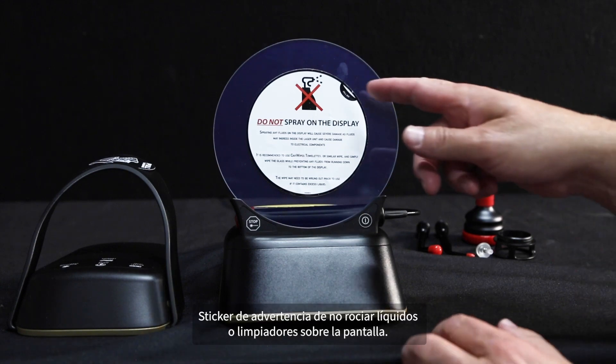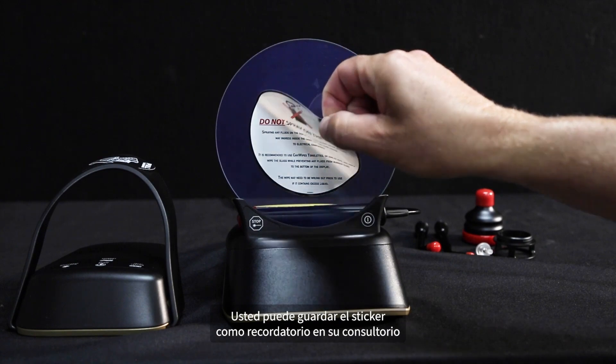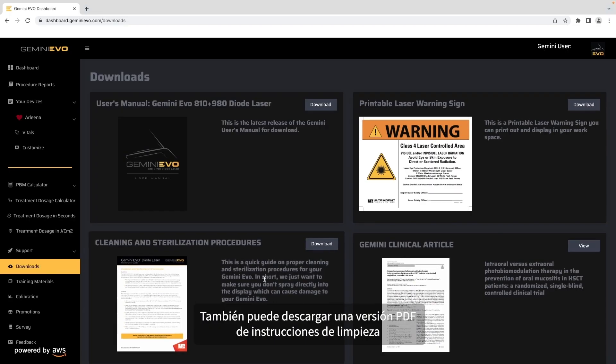On the unit, you will see the warning sticker to not spray liquids or cleaners on the display. You may want to keep the sticker as a reminder to your office. You can also download a PDF version of cleaning instructions from the Gemini Evo dashboard.